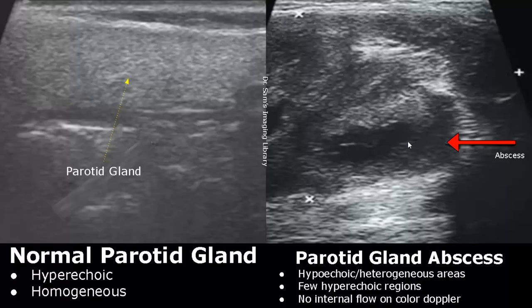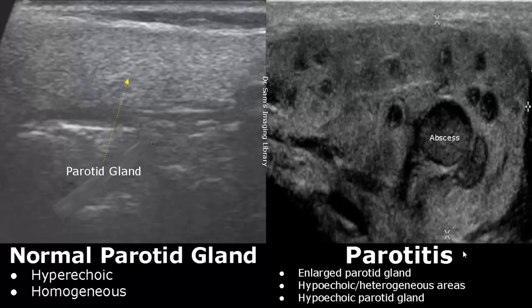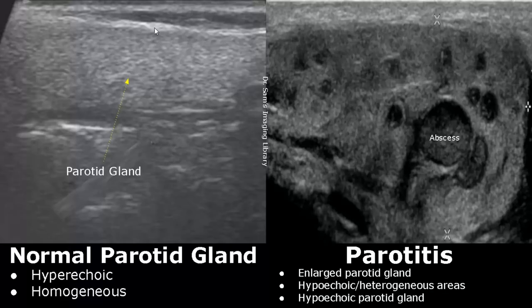Parotitis is the inflammation of the parotid gland and occurs in cases such as mumps. An enlarged parotid gland is seen with hypoechoic and heterogeneous areas. Overall, the affected parotid gland appears hypoechoic, whereas the normal parotid gland is hyperechoic.